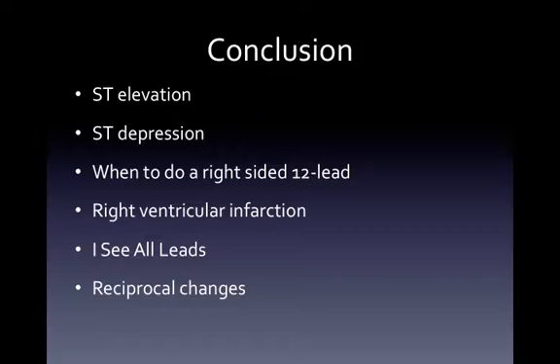If I have more ST segment elevation in lead 3 than in lead 2, I probably need to look on the right side. What is different between a right and a left ventricular infarction? The right ventricular infarction could be preload dependent. At the point that we are using vasoactive drugs and reduce the preload, very simply we could make them extremely hypotensive.